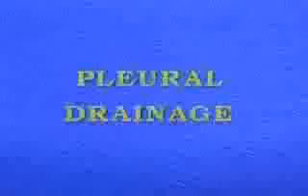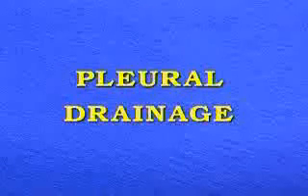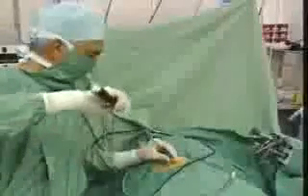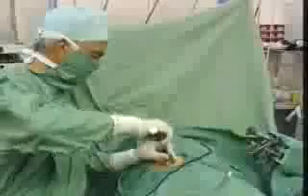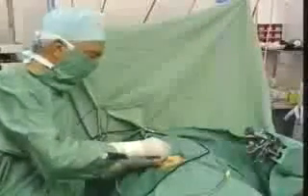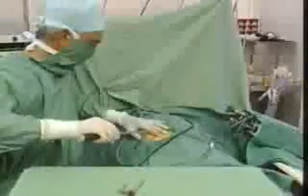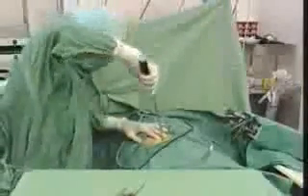The last step in any thoracoscopic procedure is drain placement. Only short drainage is necessary after diagnostic thoracoscopy. We usually remove the drain as soon as the lung has re-expanded against the chest wall while the patient is still on the endoscopy table. Most patients are discharged either on the same day or the day after the procedure. We use a malleable drain introducer with a blunt tip. These features allow optimal placement in the chest cavity.